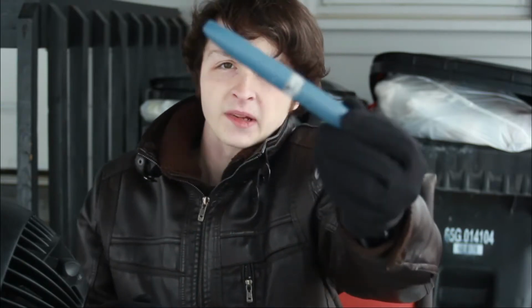Today we have a special episode where we are going to be showing you how I turned this little pen here, this Lily pen that has been provided to me by an amazing friend of mine. Thank you, Megan, for the pens. Where I turned one of these pens into the precision pen tool that I've talked about before. I'm going to show you the whole process from step A to step Z.